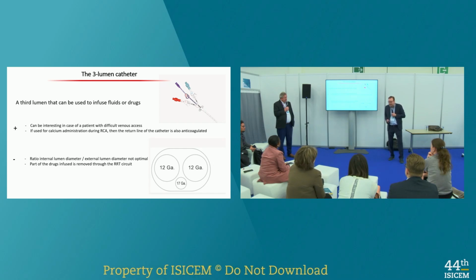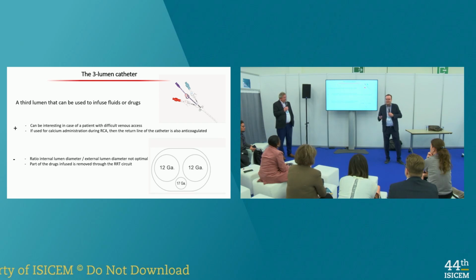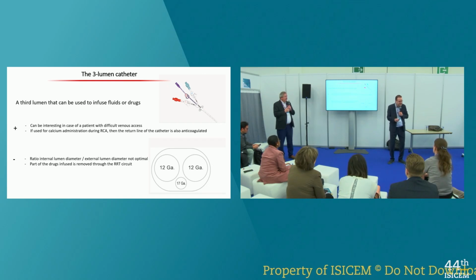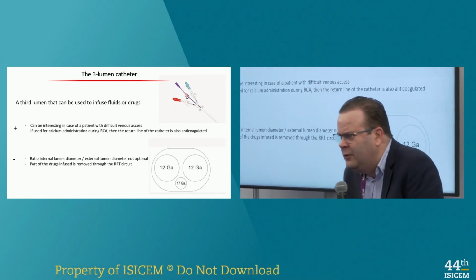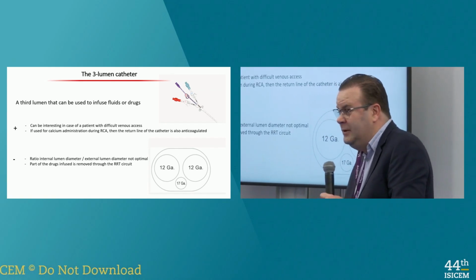And actually, it's very funny because when you go to a unit, they say, oh, last year we switched to citrate. Thank you so much. It's very good. We are very happy with citrate. But sometimes you go to a unit and they say, we are very disappointed with citrate. Sometimes you find this kind of team in some countries. Each time you have this, I guarantee it's because they don't use correct catheters. They use a bad catheter. And with heparin, it was okay, a little bit. But then they switch to citrate, and it's a disaster, because the catheter is not good.